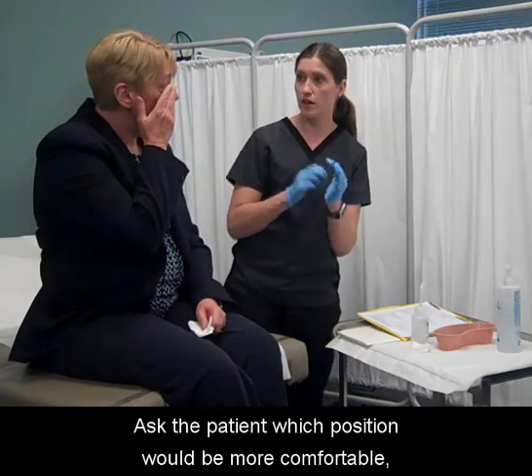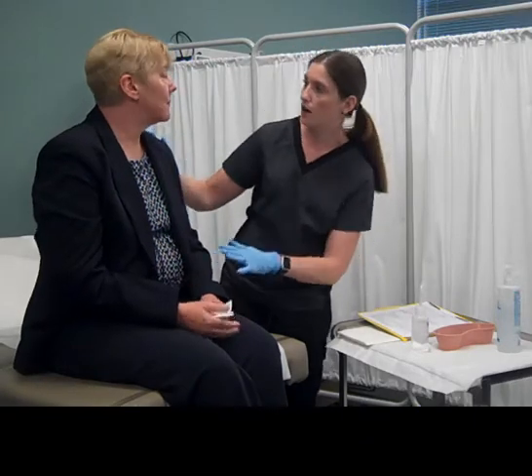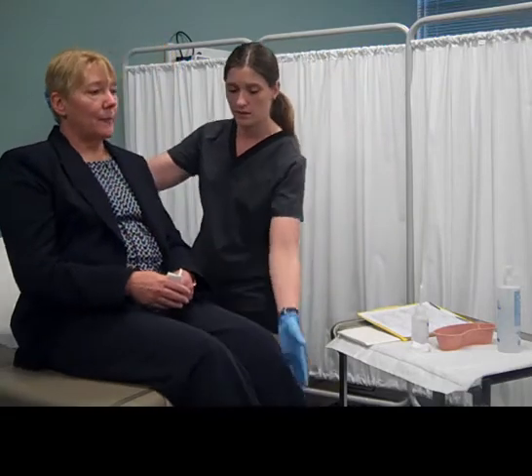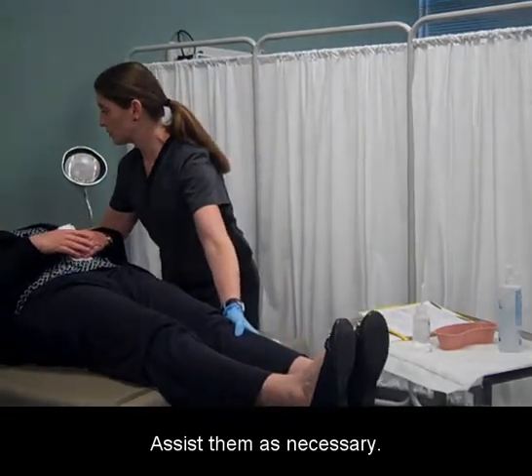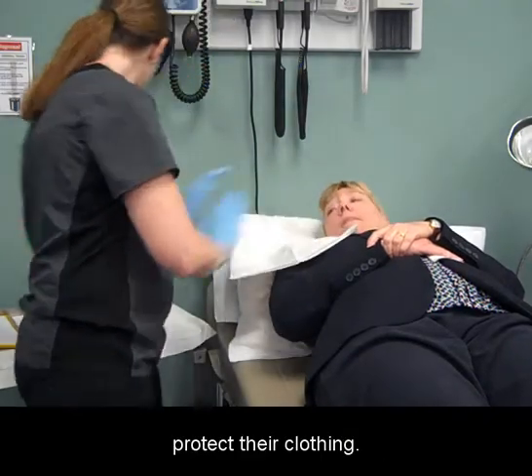Ask the patient which position would be more comfortable, sitting or lying down. Assist them as necessary. Drape the patient with an absorbent pad or towel to protect their clothing.